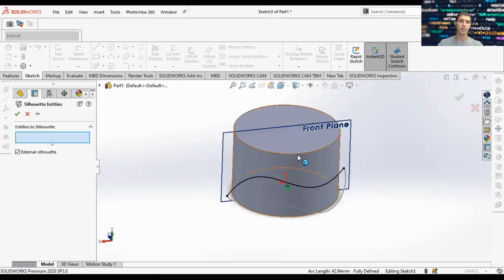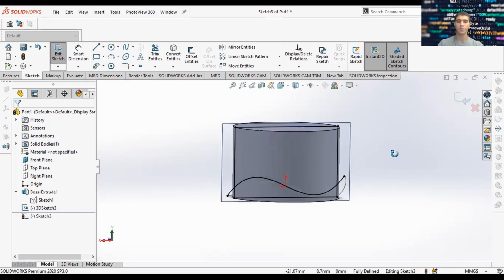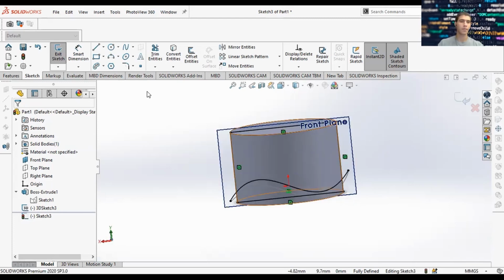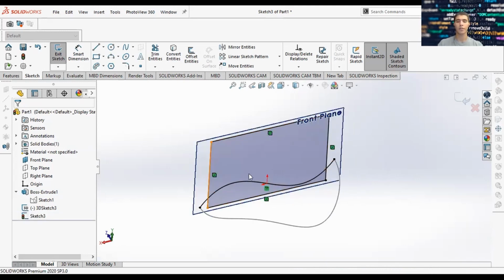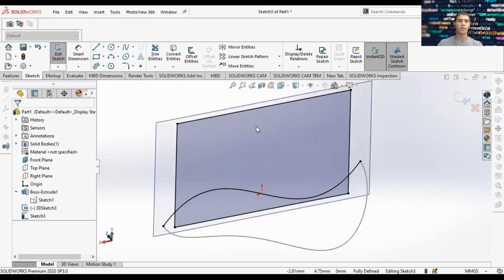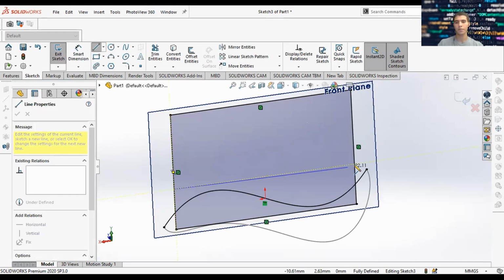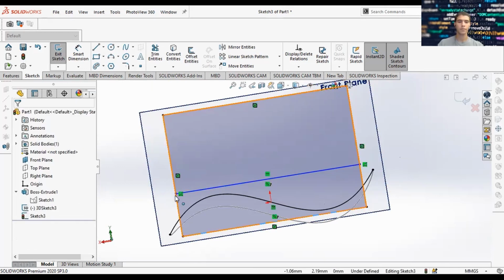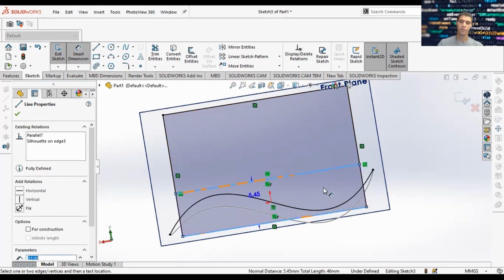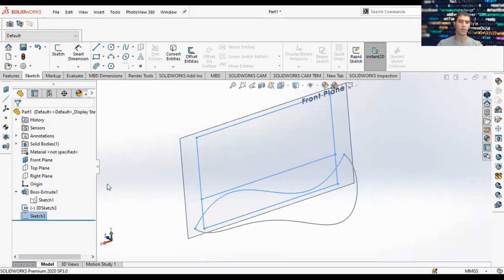Now we're going to use another function called silhouette entities. We're going to select this body. So we selected this body, and now let me hide it. So that body is hidden, and we have a sketch, kind of like a cross section of our equation-driven curve. Let's go ahead and include a line here, and set these 2 lines parallel, and add a dimension constraint.